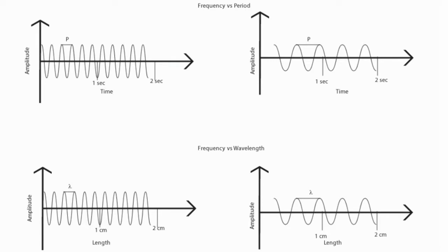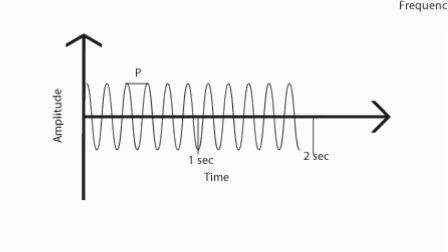First, the frequency. Frequency is the number of cycles per second. What is the cycle? Remember when we discussed the formation of sound wave? We found out that particles of the tissue are bouncing back and forth from their resting location all the way to the right, then all the way to the left. Remember that? Then back to their resting place. This movement is called a cycle. So again, frequency is the number of cycles per 1 second.